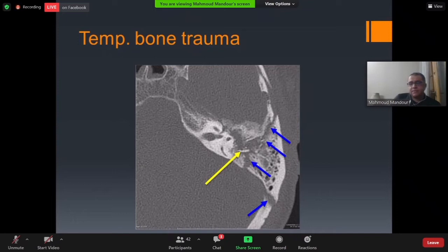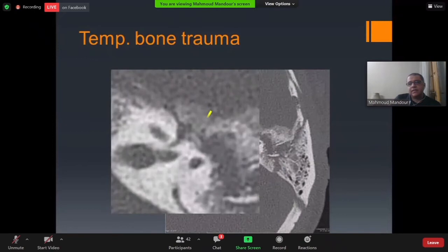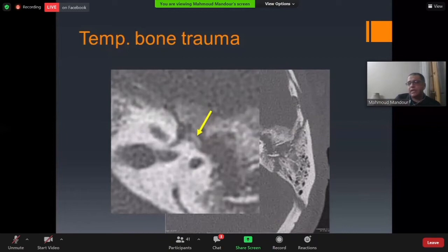Here we can see a dislocated or impacted piece of bone at the site of the facial nerve. A fractured bone fragment is clearly encroaching on the beginning of the tympanic part of the facial nerve — this is an absolute indication for surgical exploration.